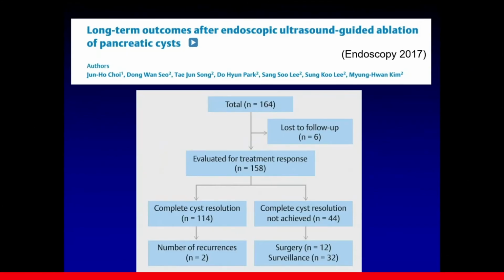We analyzed our long-term outcome data after EUS-guided cyst ablation and reported the result in Endoscopy 2017. Among 164 included patients, 158 patients received long-term follow-up. The mean follow-up was more than 5 years, and some of the patients received follow-up for more than 10 years.